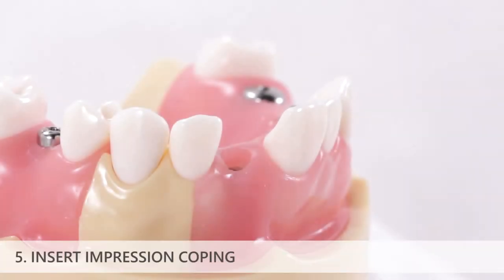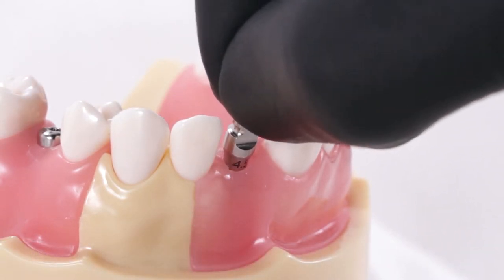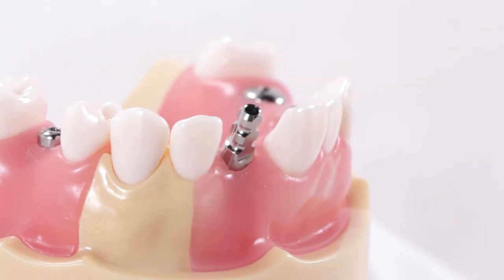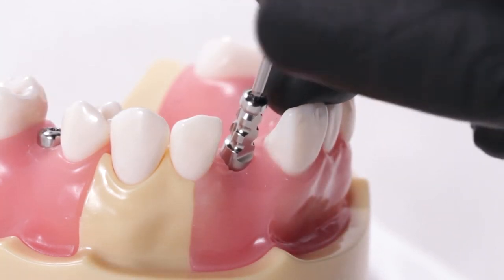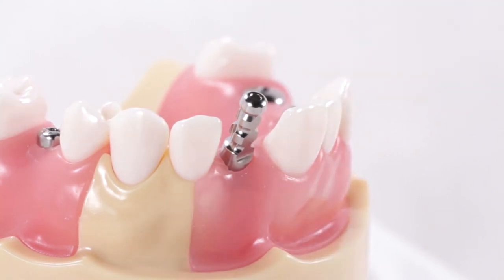Insert the closed tray impression coping onto the implant. If using an impression coping with a hexed interface, rotate the coping slightly while inserting it to ensure that it drops into the engaging implant interface. Once seated, insert the impression coping screw and use the prosthetic driver to hand tighten the screw to about 5 to 10 newton centimeters. The impression coping does not need to be fully torqued into place.